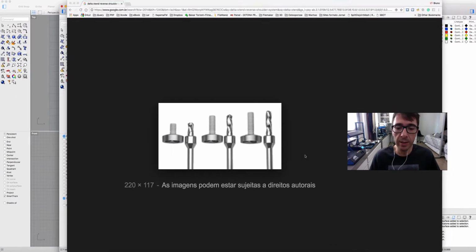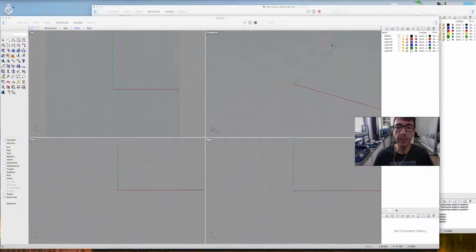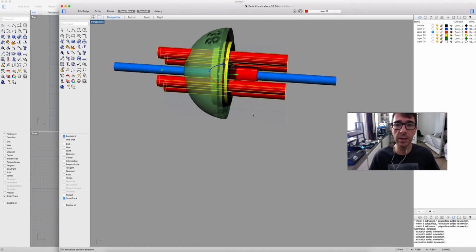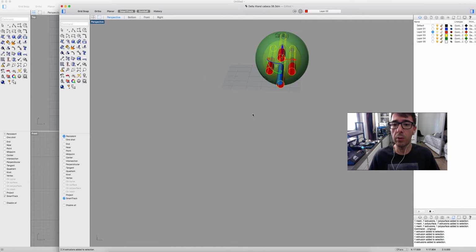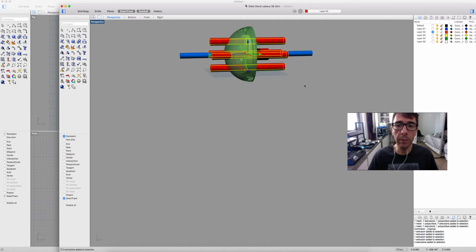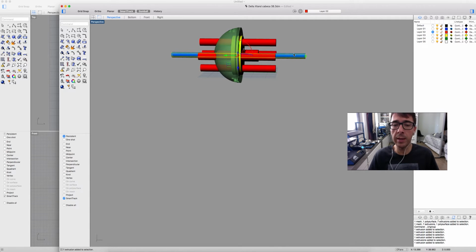I'm just showing this. So this is the central peg, this is the base plate, and the other red cylinders, these four red cylinders, correspond to the location of the screws. And we made this blue cylinder, which is the central pin guide. This is important for the surgery. This is not in the model, but this is important for the surgery.